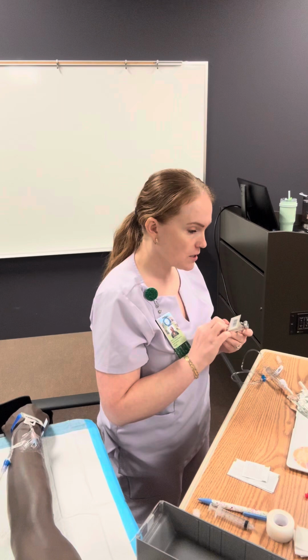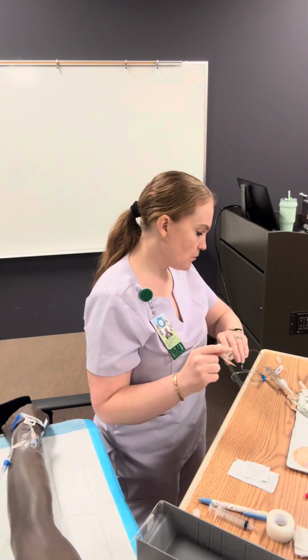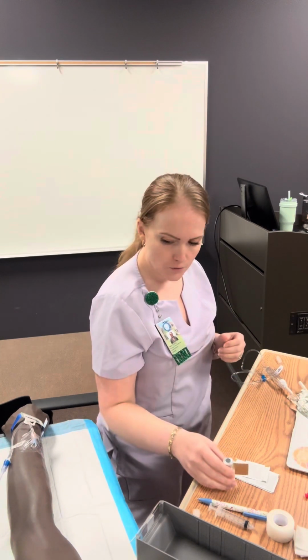The time to be given is 7:14 in the morning. It is 7:14 in the morning. So I am good to go with our first medication.